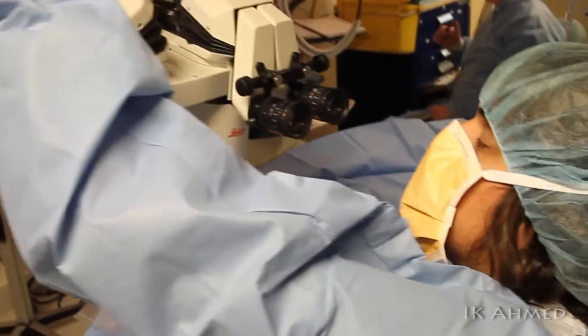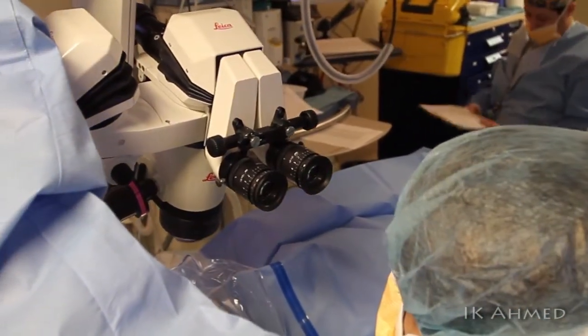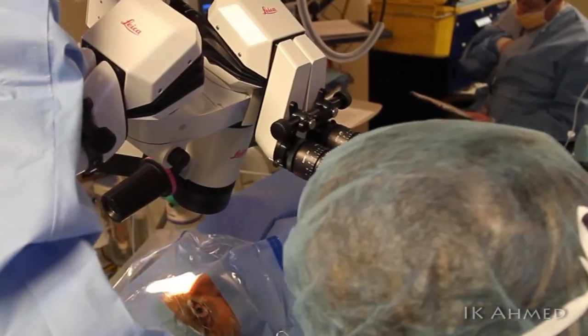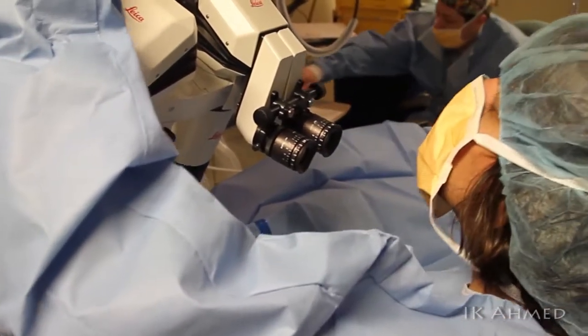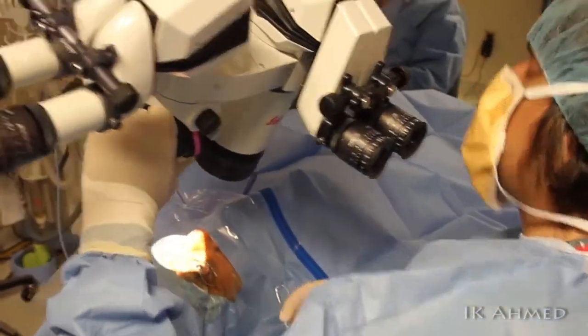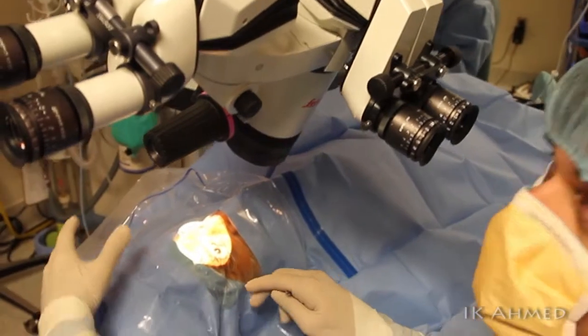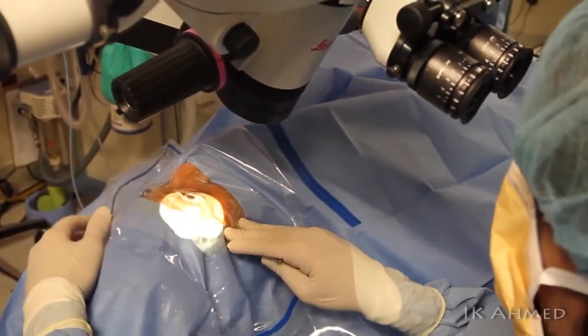The first step is to tilt the microscope about 30 to 40 degrees away from the surgeon, as we see the scope being tilted. We will then also rotate the patient's head about 30 to 40 degrees as well, and this will allow a reasonable line of sight with the use of a gonioprism to visualize the angle.